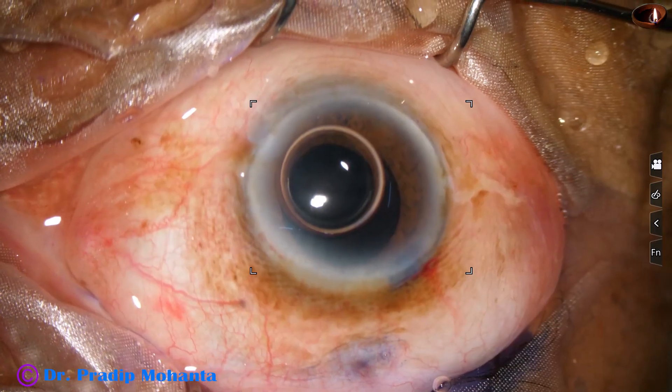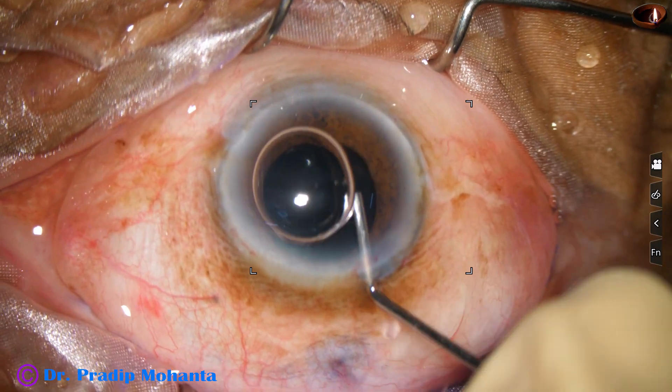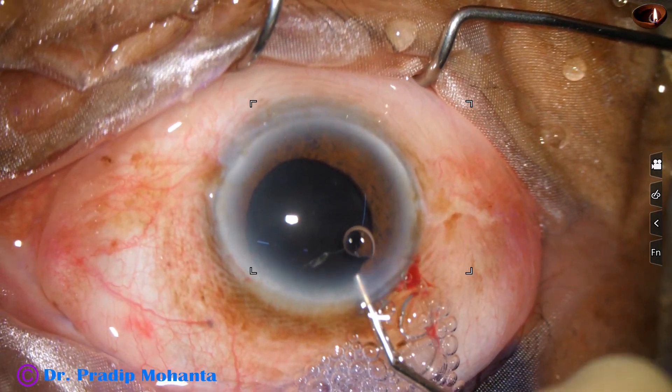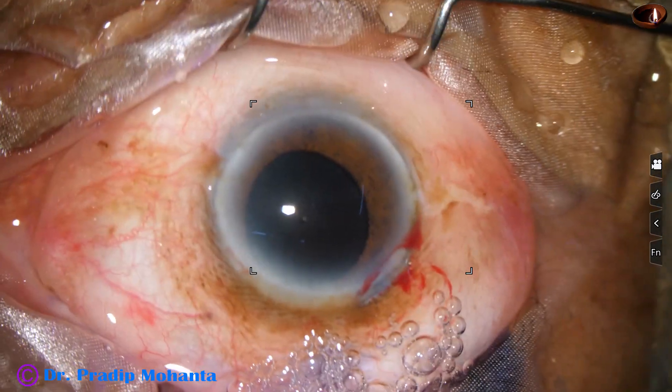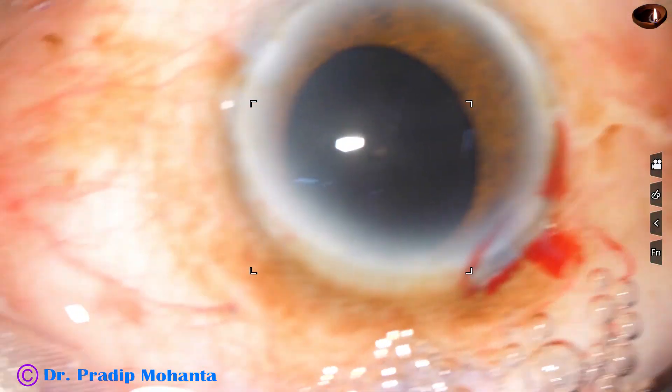The pupil has not dilated well. There is mild floppiness of the iris. These are additional challenges. A black cataract with a floppy iris is a great challenge.